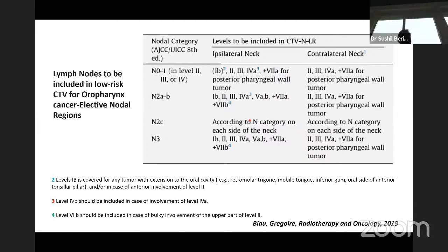Now, there is some data which recently got published in nasopharyngeal cancer that even if you spare the superficial parotid on the side of involvement, keeping V26 less than 30%, you can still decrease the risk of xerostomia. So don't get overzealous and try to spare the entire parotid on the side of involvement. You can focus on the superficial parotid, but more importantly, focus on the contralateral parotid, because that is more important than sparing the ipsilateral parotid.